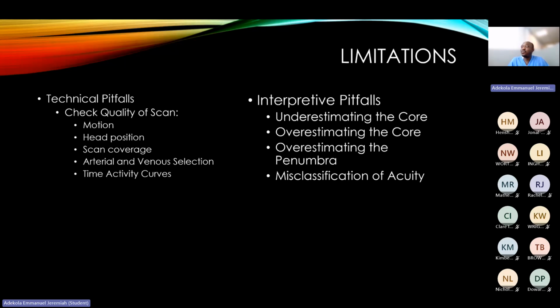And one of the ways you could see a false result, or a pointer to it on the scan, is the volume of the Tmax will always come as infinite, which means that this scan cannot be interpreted. So when that happens, we need to have a look at the graph to see if it was done properly.